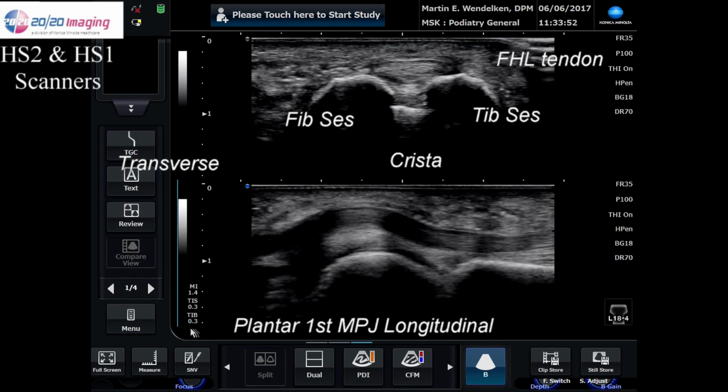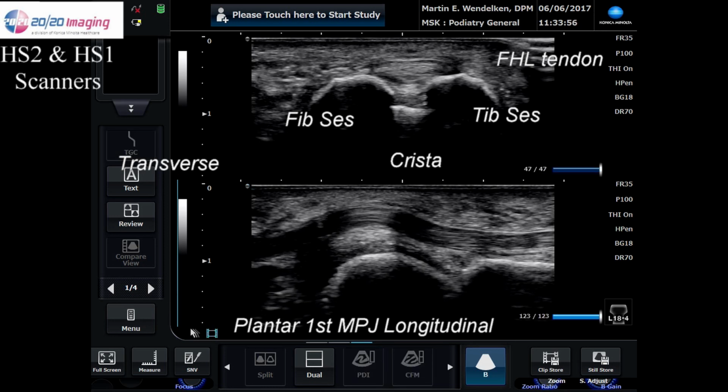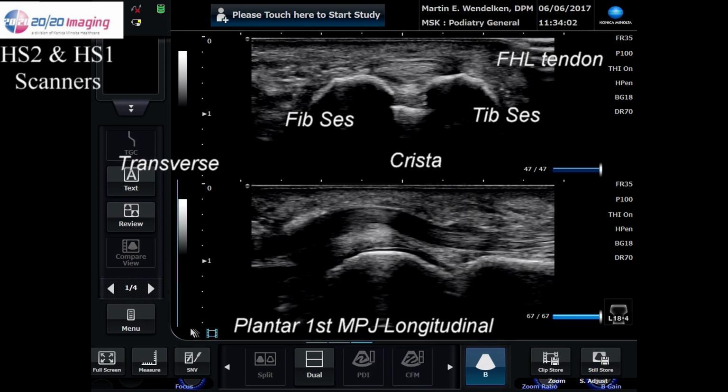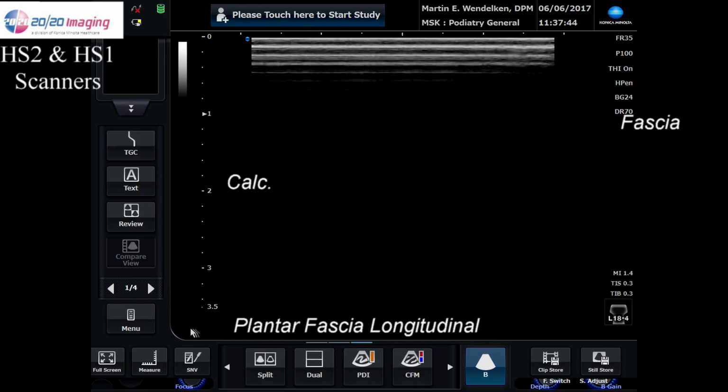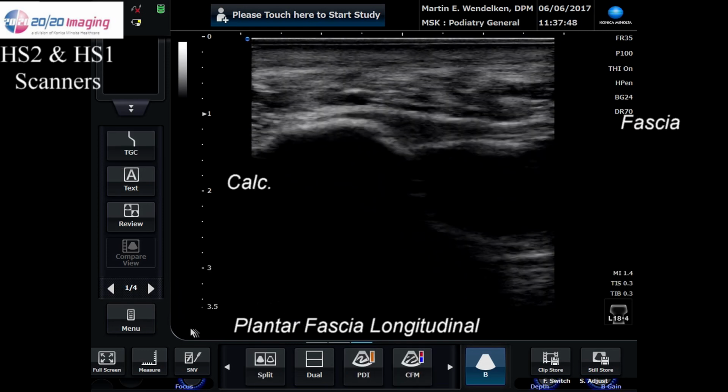If we split the screen and flip in the long axis at the same time, now you're looking basically between the two sesamoids in the long axis, where you see the long view of the flexor hallucis longus tendon and the joint capsule.